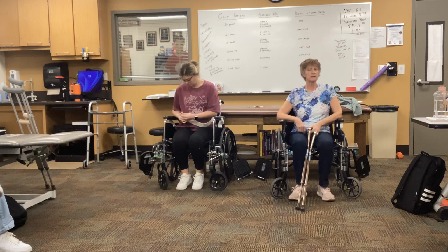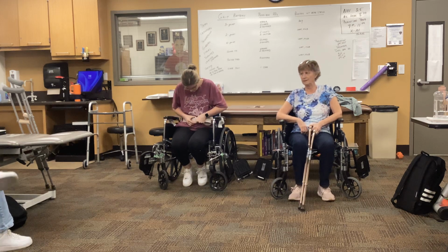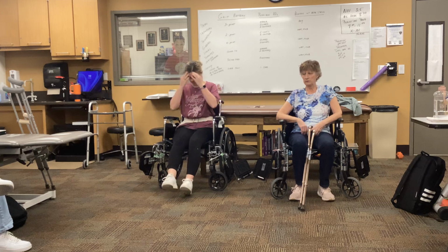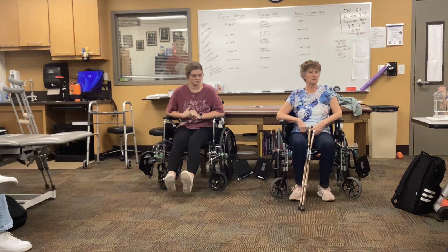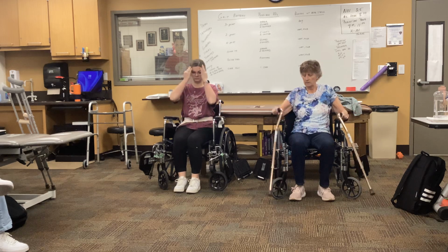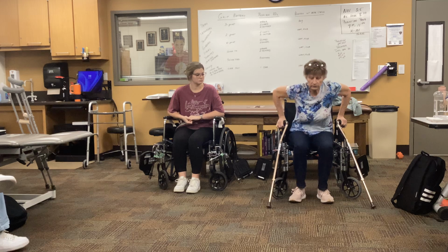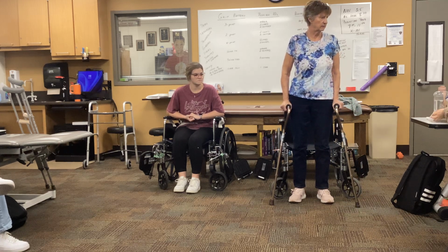Okay. Then we have a 2-point and a 4-point gait. And again, these are full weight bearing gaits. Can be done with either 2 crutches or 2 canes. Okay. So let's take a look at what it looks like with 2 canes. Okay. So, starting point to stand up, slide forward, push from the chair. The patient has both canes together.